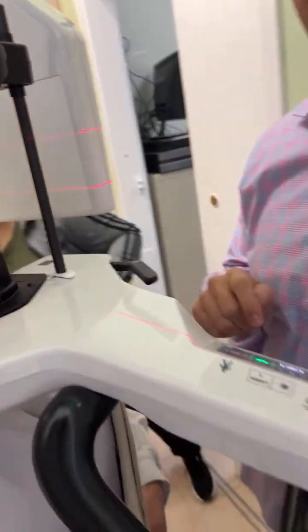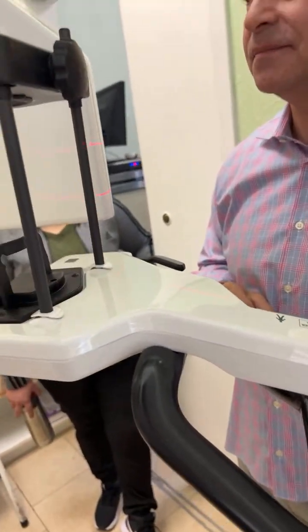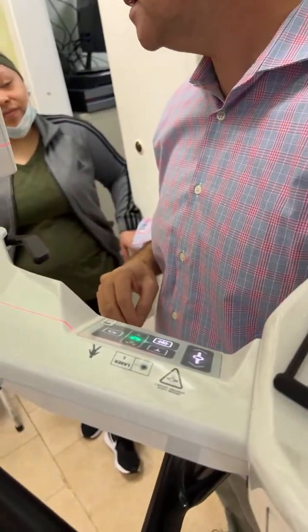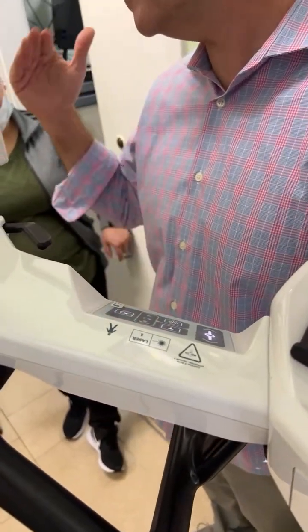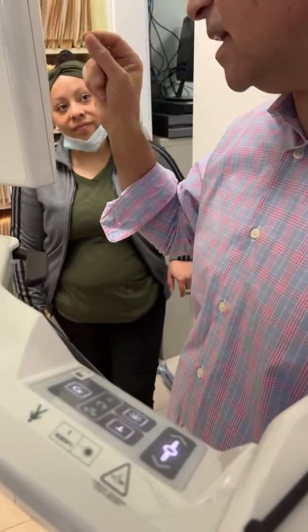No, that's too much. You don't want to take that much, right? So 5 by 5, take only up to here, the bone chip. That's where you have to customize this. Don't just rely on the lasers. The lasers are a good ballpark and give you an idea, but when you take the scouts, that's going to tell you exactly.